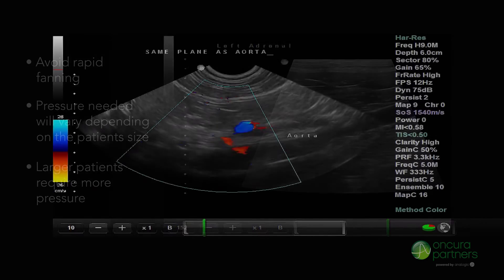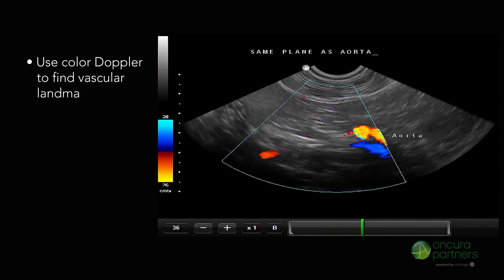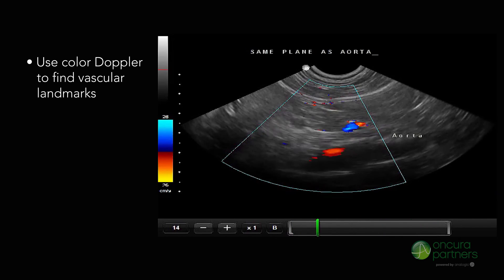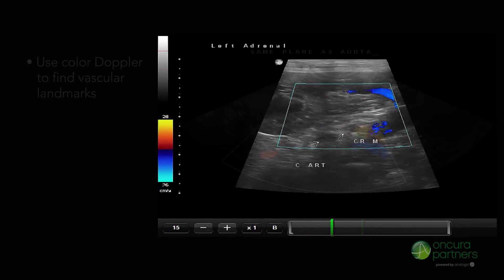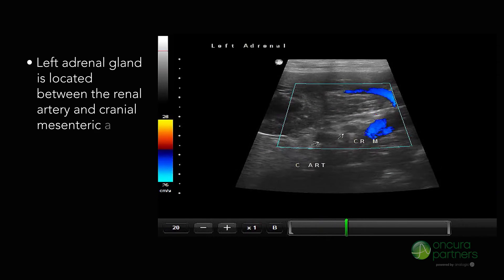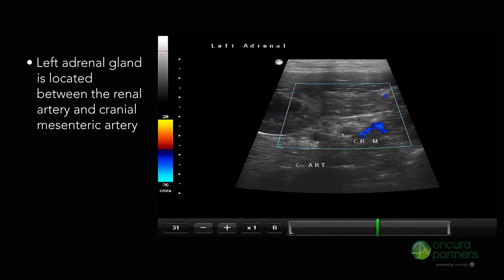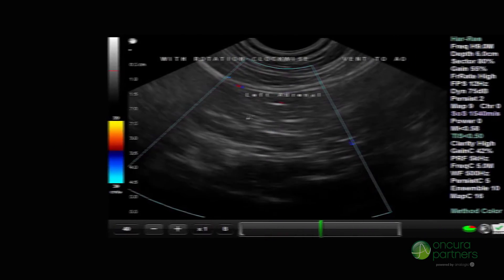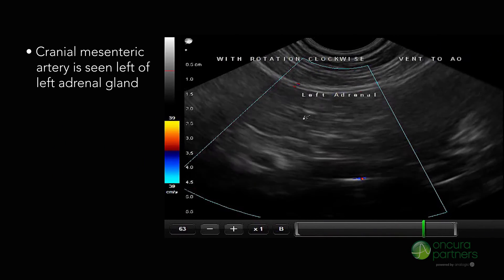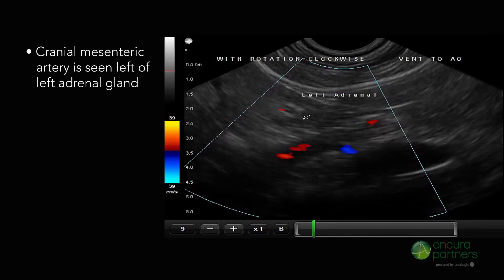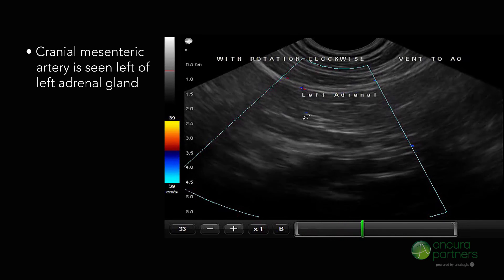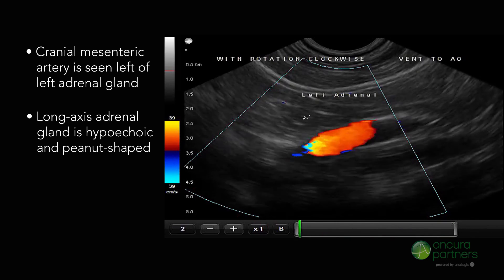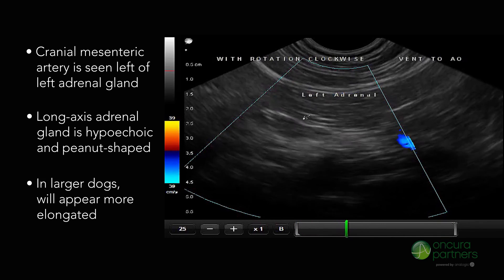Use Doppler to localize the vessels entering the aorta, specifically the left renal artery. The left adrenal gland lives between the renal artery and the cranial mesenteric artery. The cranial mesenteric artery can be seen cranial to the left adrenal gland. On the left side, the long axis plane of the adrenal gland is hypoechoic and peanut-shaped.